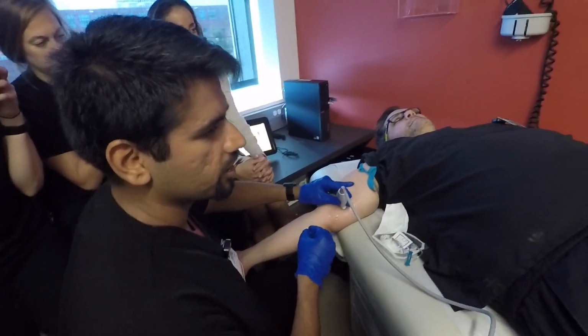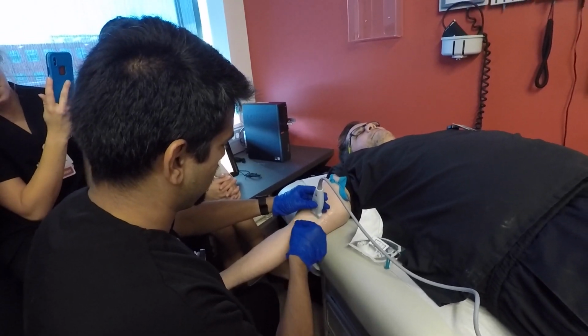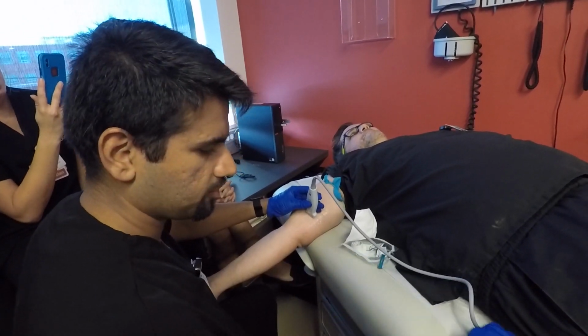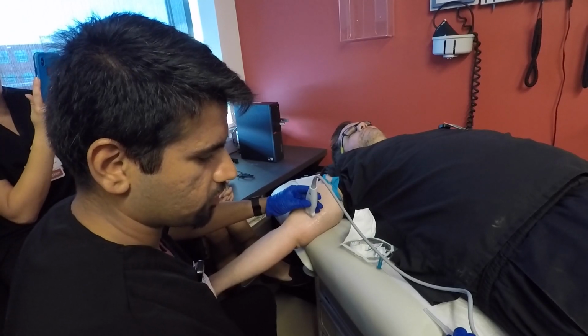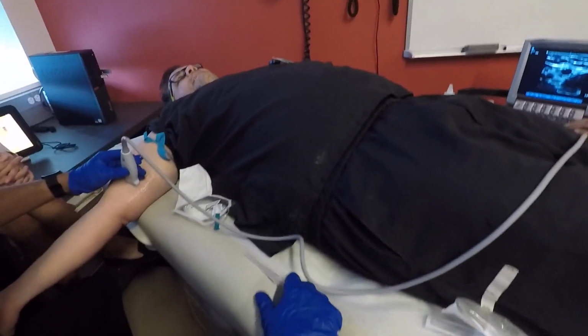Right about there, nice big target. You'll prep the site. Dr. Byrne, you'll feel a sting very shortly. I'm going to give it a few seconds for that to finish drying. So then we also use these long angiocats. They're about 5 centimeters long, actually 4.9 to be precise.